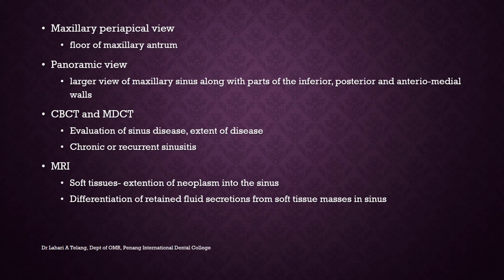The major methods of imaging of the paranasal sinus are a simple maxillary periapical view, which can show you the floor of the maxillary antrum, and a panoramic view, which can show you a larger view of the maxillary sinus along with parts of the inferior, posterior, and anterior medial walls.